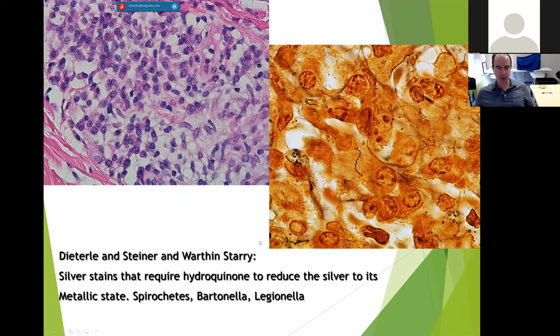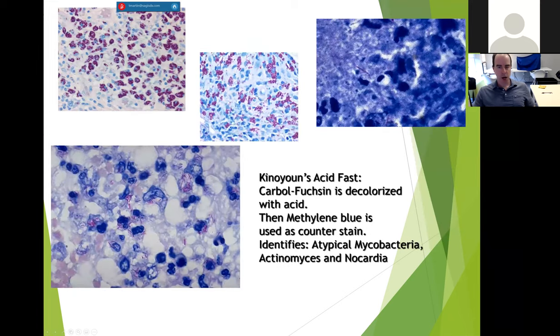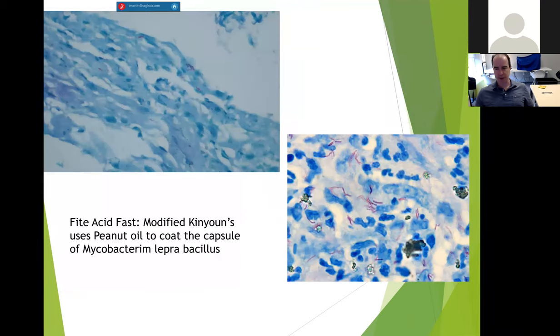So here's an example of spirochetes in tissue right here. This is what they look like with a silver stain. All right. So Lyme disease, syphilis would look like this. And with AFB, they stain very bright pink. So here they are. These are macrophages loaded with acid-fast bacilli. So then you can also do Nocardia and Actinomyces, some of these with these modified methods. So there's just all these different methods, but basically AFB stain red.